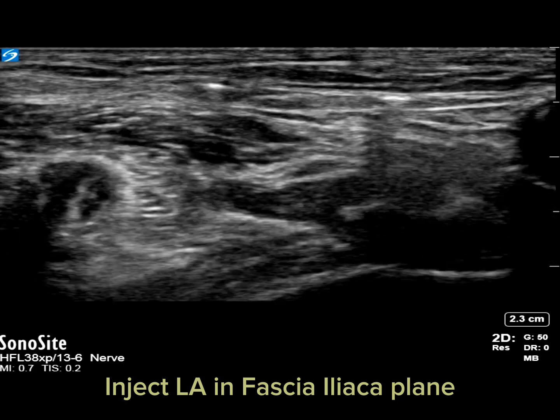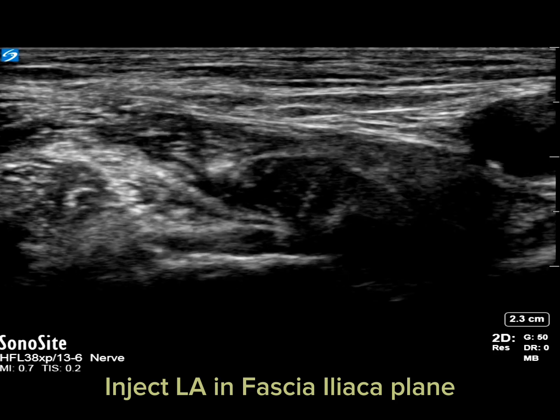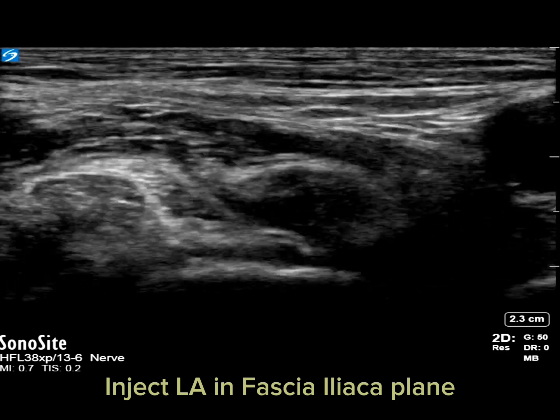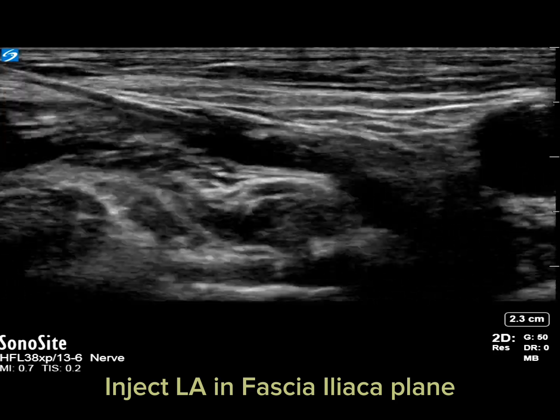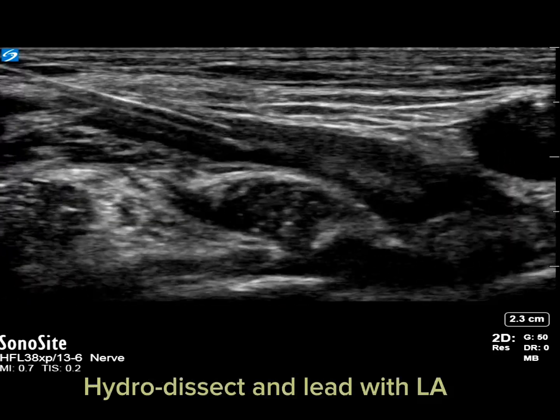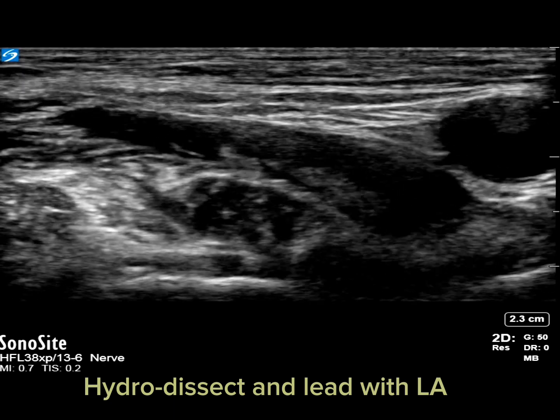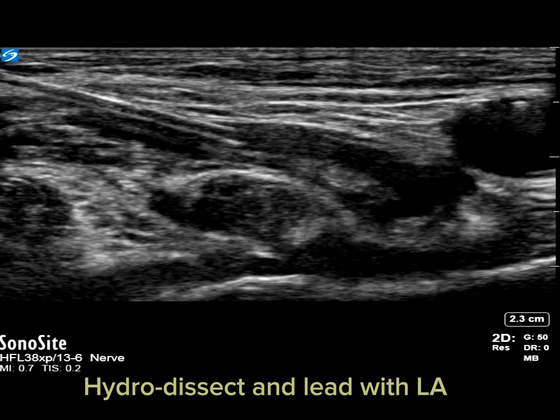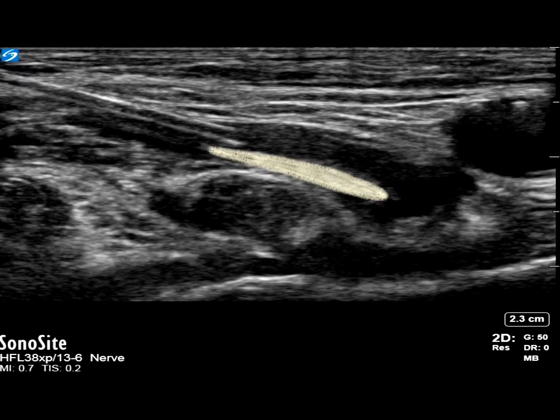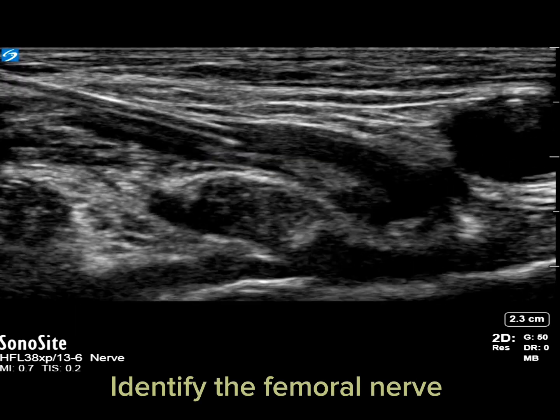The spread looks good. You can see the local anesthetic spread and push the femoral nerve down. Hydrodissect and lead with the local anesthetic. Here you can identify the femoral nerve clearly.